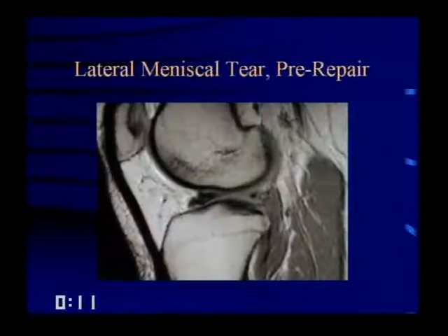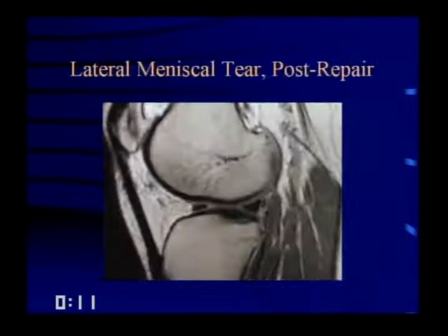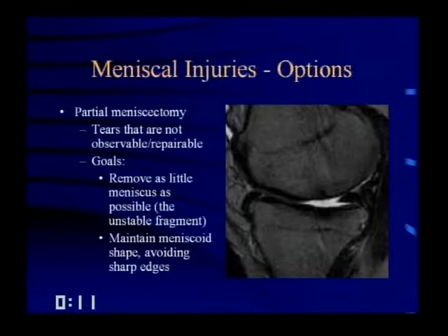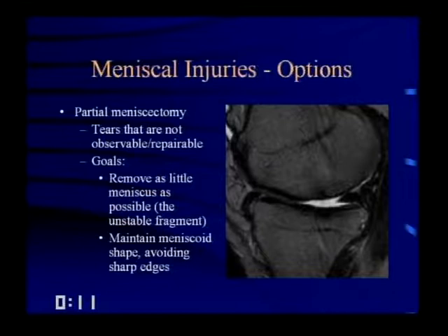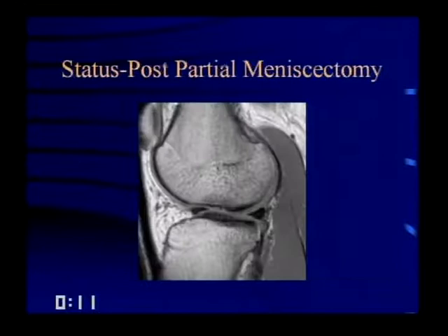Here's a nice example: a bucket handle tear of the lateral meniscus repaired with sutures, looking practically as good as new. Partial meniscectomies are performed for tears that are not observable or repairable — particularly those in the central two-thirds near the free edge. The goal is to remove as little meniscal tissue as possible: just the unstable fragment, maintaining the meniscoid shape and avoiding sharp edges. Here's a patient status post partial meniscectomy where the menisci look fairly normal.